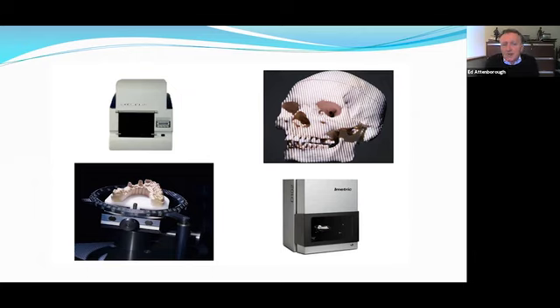The disadvantage is that, just like your PowerPoint projector, it has a certain depth of field through the optics to project this pattern, and it means that the pattern's only in focus within a certain depth of field. So depending on the distance of the scanning arrangement from the object, the accuracy of the recorded data can vary, but the data acquisition rate, the speed of scanning, is much higher than laser scanning.